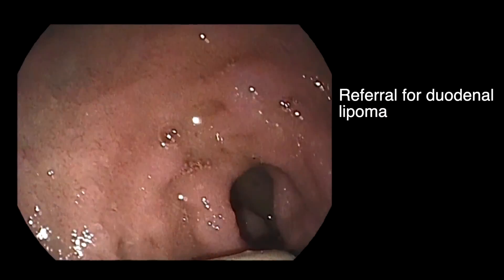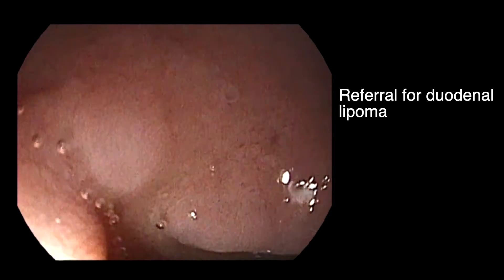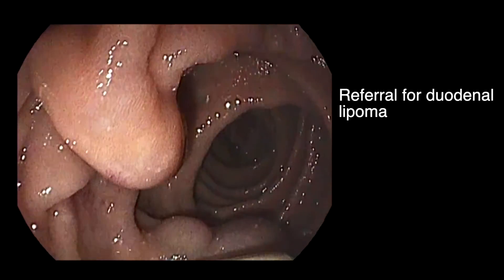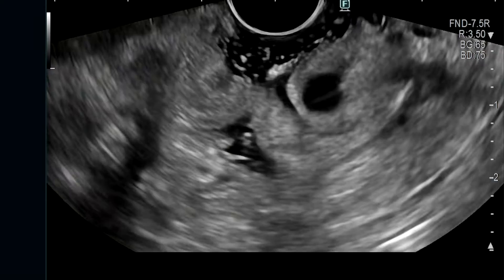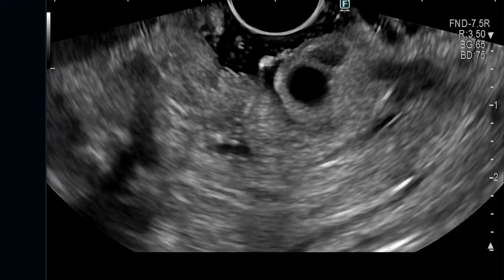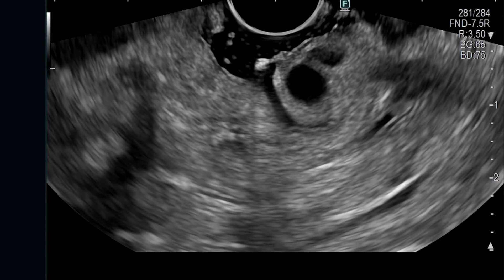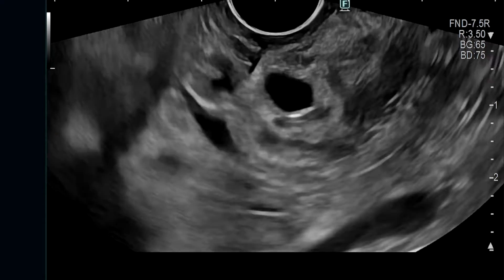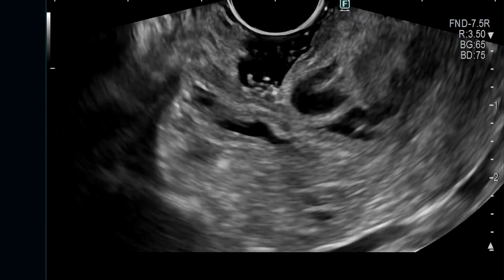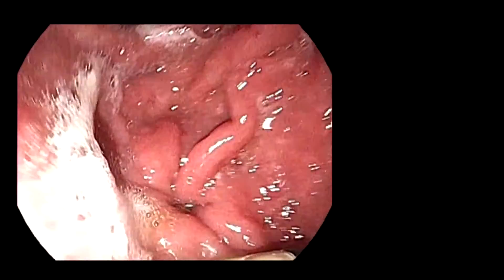This 70-year-old patient was referred with a duodenal lesion as seen on gastroscopy, thought to be a lipoma. After instillation of water, an anechoic lesion was seen in the submucosal layer, consistent with a benign cyst.